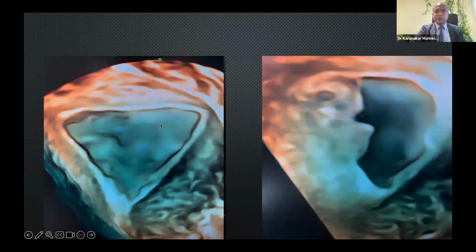And this is the anterior posterior view of the 3-dimensional contrast scan. Contrast is saline. You can see uneven elevation on the posterior endometrium. But that is the AP view. I want to see my own face here to show you whatever. So that is the AP view. Now I turned it this way because if there is a pathology on the elevated polypoidal posterior endometrium, you need to turn the uterus to the sagittal plane within the 3D to see the uneven thickening of the posterior endometrium.